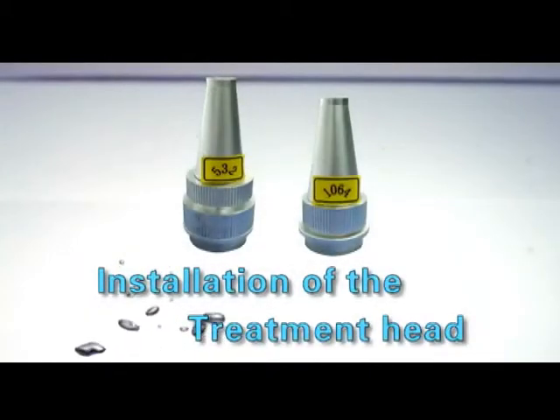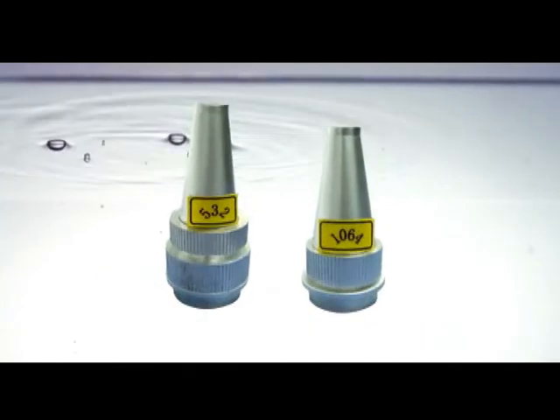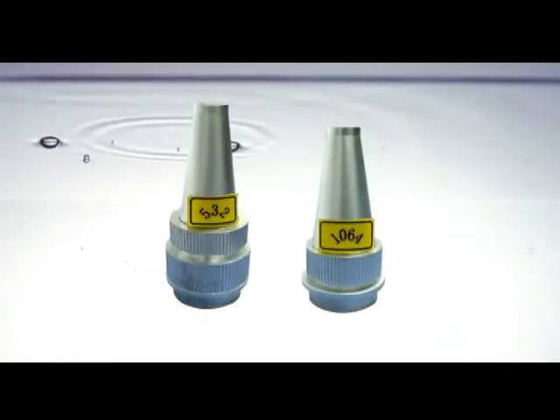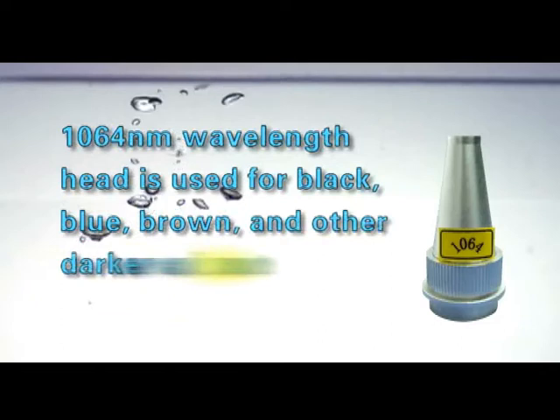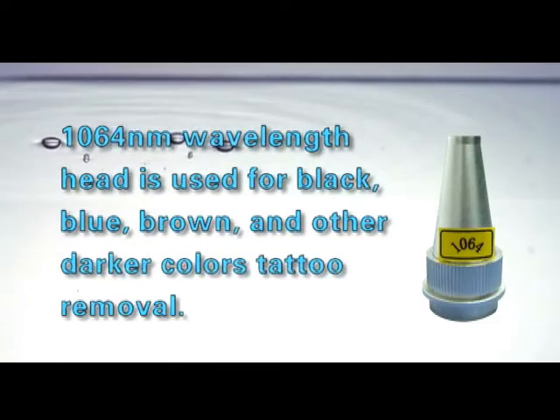Installation of the treatment head: the laser machine has two treatment heads — the 1064 nanometer head and the 532 nanometer head. The 1064 nanometer wavelength head is used for black, blue, brown, and other darker color tattoo removal.